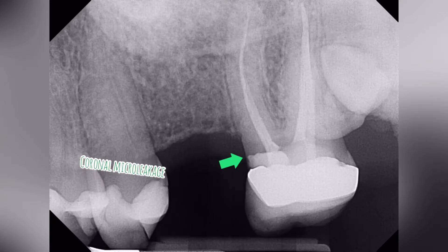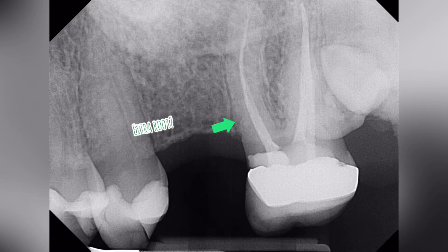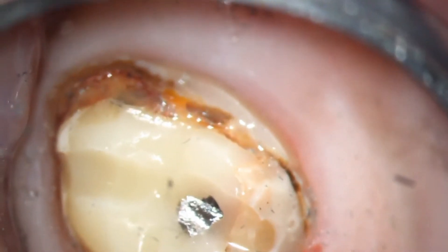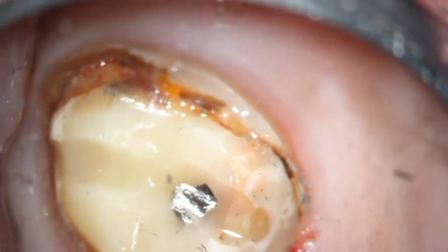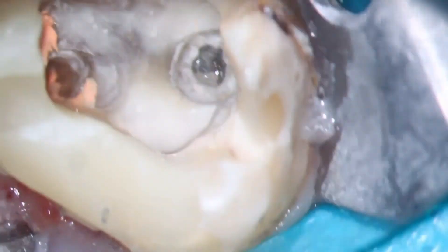It could be coronal micro leakage happening underneath the crown, or there could be an extra root. So because of the potential decay underneath the crown, we went ahead and removed the crown, and we observed the decay on the mesial aspect. After excavating the decay, we were able to find the roots with the fillings and a post in the palatal canal.